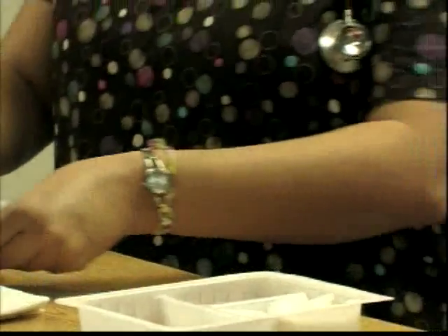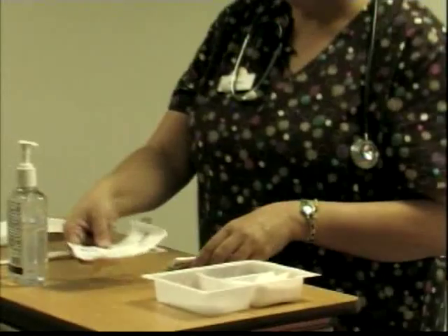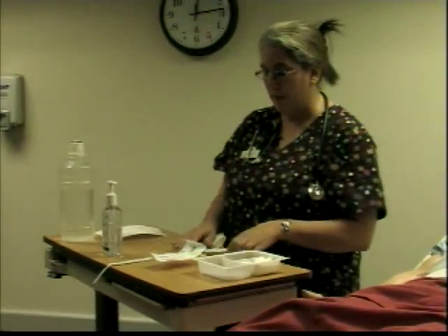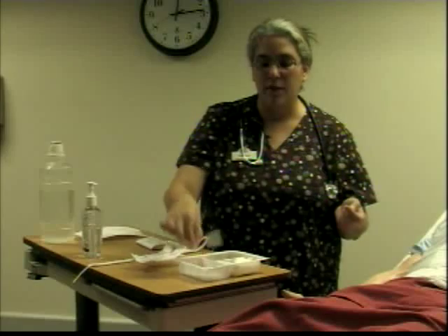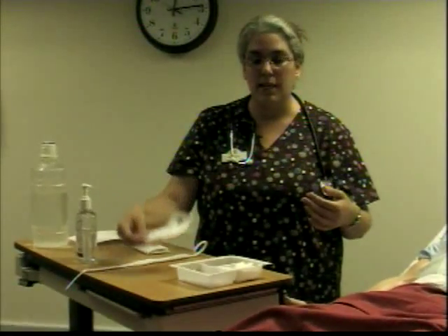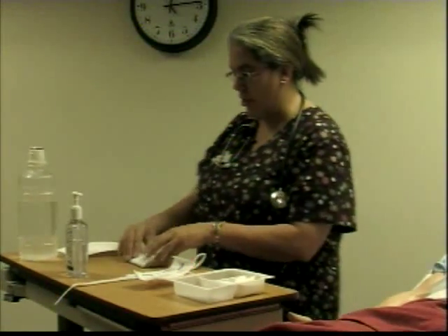Now I want to highlight a couple of things in here with regards to the sterility of this procedure. Before, when we used to have metal trachs or any other equipment, we actually will take the inner cannula out. In this reservoir right here with these little things, we'll be cleaning the inner cannula, rinse it in this one, and then replace it. Now we don't have to do all that. We actually just replace the inner cannula like I mentioned before. So when I do the procedure, pay special attention to that.